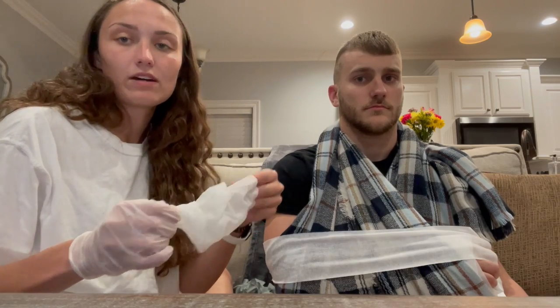Once I have finished splinting the forearm and applying the sling and swathe, I'm going to remove my gloves and properly dispose of them. And then I am done. And that is how you splint a forearm and apply a sling and a swathe.